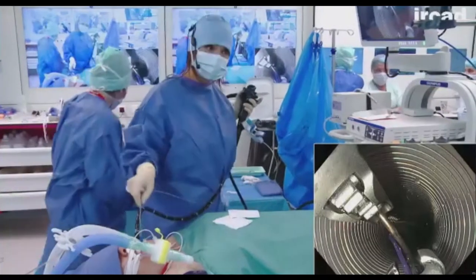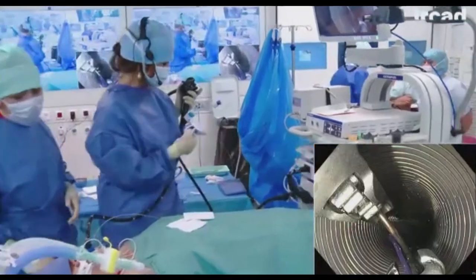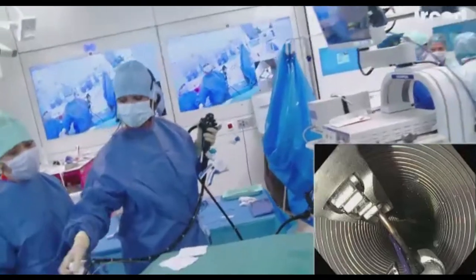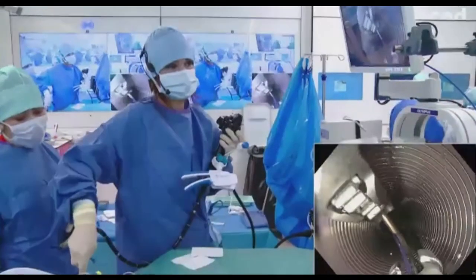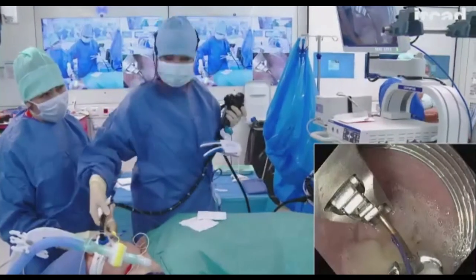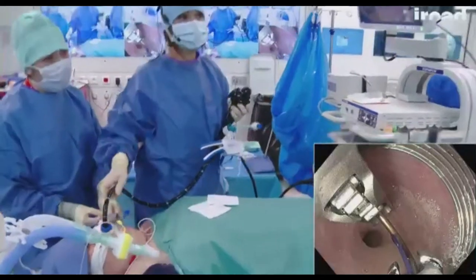Very important when you're introducing the scope to keep the cable that links the handle to the tip of the scope in the same position to avoid any curling and kinking around it. So we're going to go very gently. Then Rita now is slightly inflating the balloon. Can you deflate and inflate again? So we're going to show it.